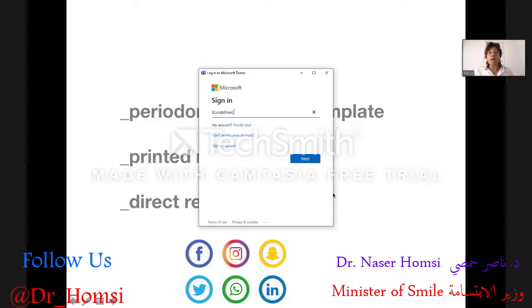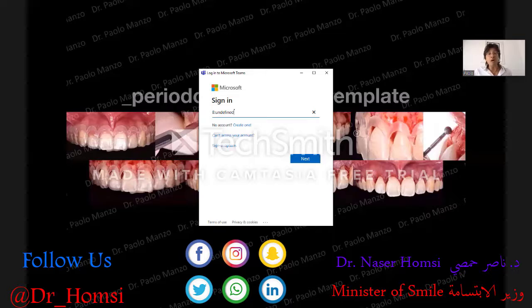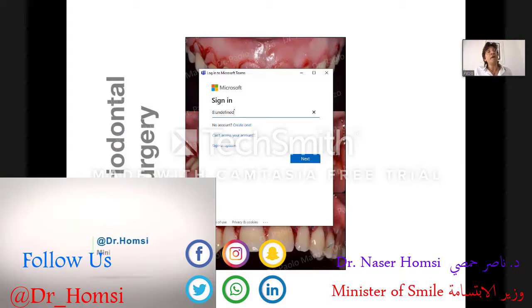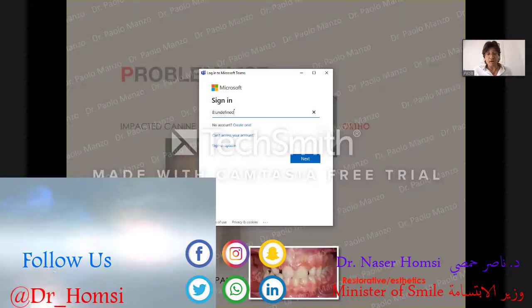So I went on with the digital workflow, we can print the periodontal surgical template, a resin mock-up, and we can also print some direct restorative guides. Now we can use the periodontal surgical template, and in this way our periodontist can perform a very easy, very reliable surgery. And this was the surgery of Tiziana, moving the bone and moving also the gingiva, okay?